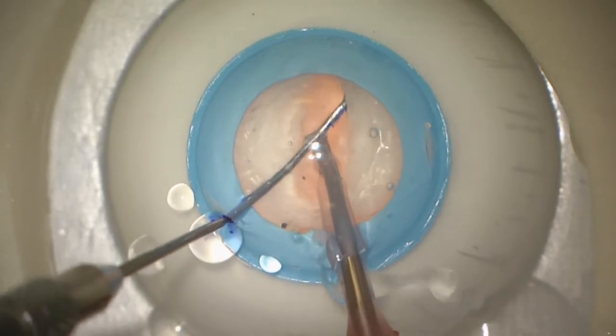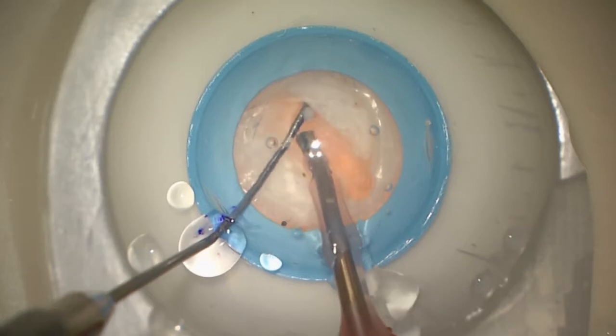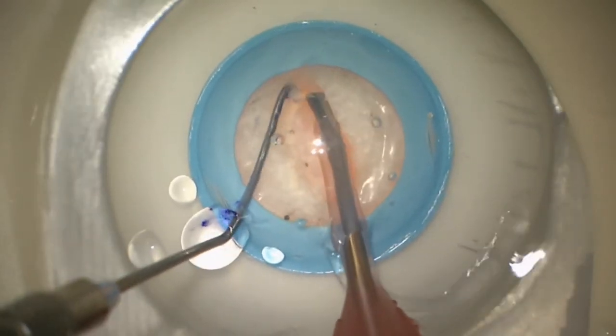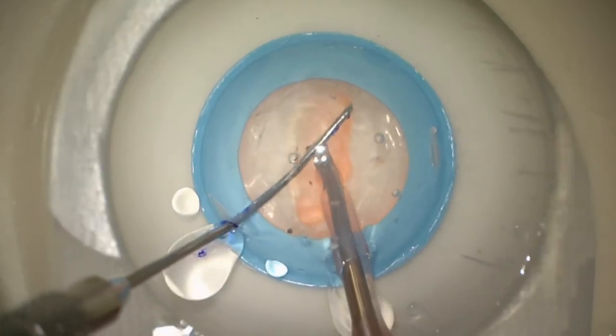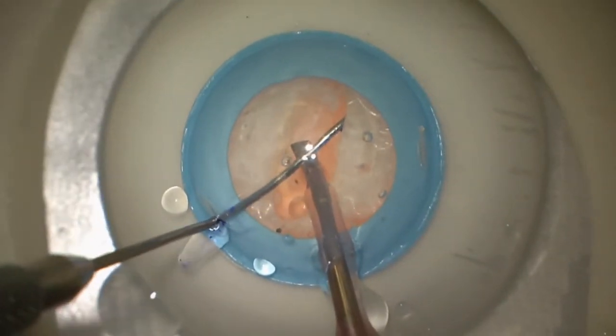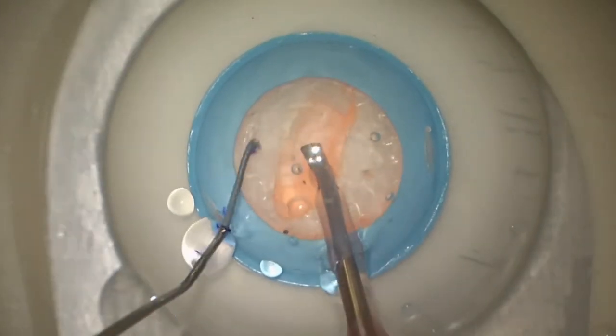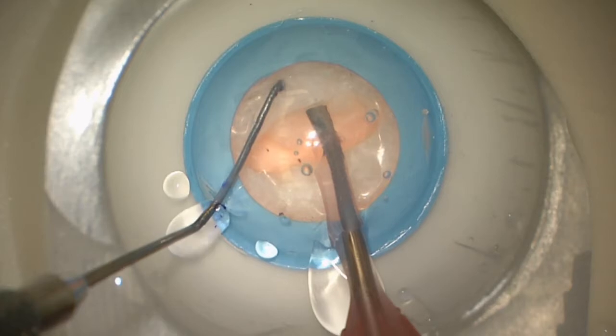Spinning the lens can easily be done with these eyes, and again the sizing is right so that we don't have awkward issues like you do with porcine eyes, which are too big. Now that we've got the lens into two pieces, we're going to stop doing the divide-and-conquer and start doing the chop — that's why it's called stop-and-chop.